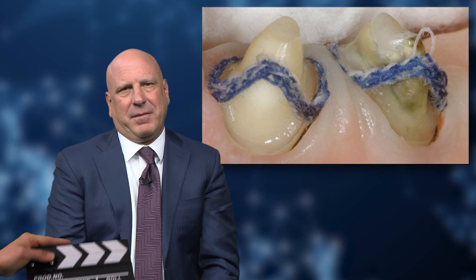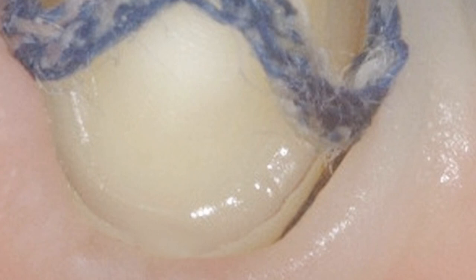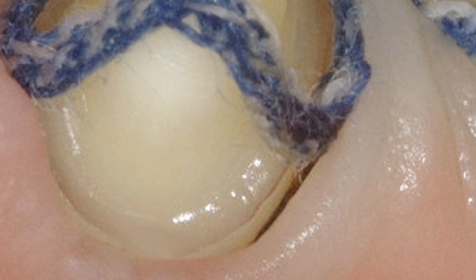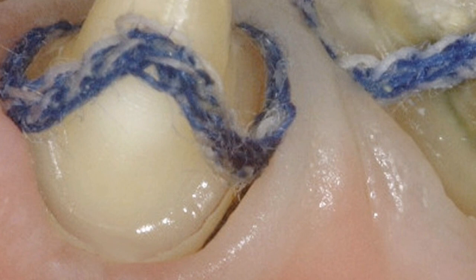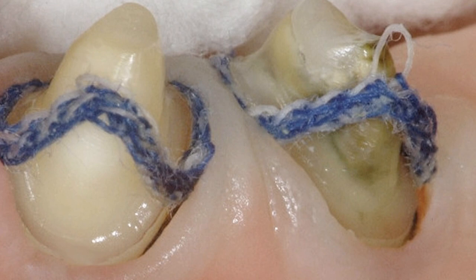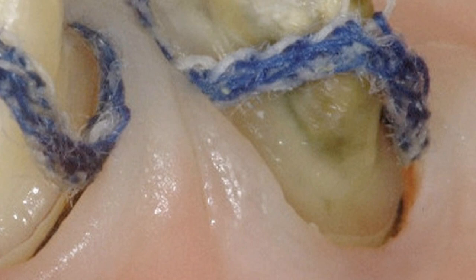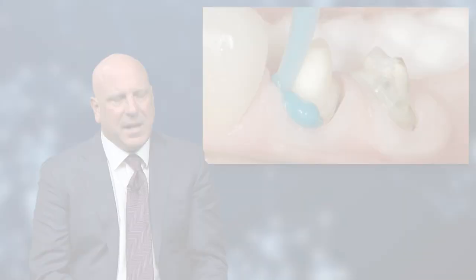As we look at this picture on the screen, you can see I've teased the number two cord up out of the sulcus, and you can still see the black double zero cord at the base of the sulcus. There's no skill here — what's the skill in putting a double zero cord? None. It's simple. A number two cord is slightly harder, but it's not hard. It does take time, and for me it's more of a heart thing — caring enough to spend the time to put a second cord in for your technician. Dentists find cord packing annoying and will do almost anything to avoid it, yet it is clearly the gold standard for getting great retracted impressions that lead to amazing models.